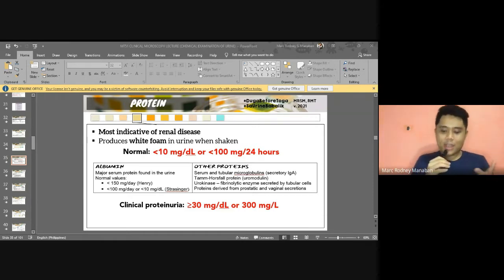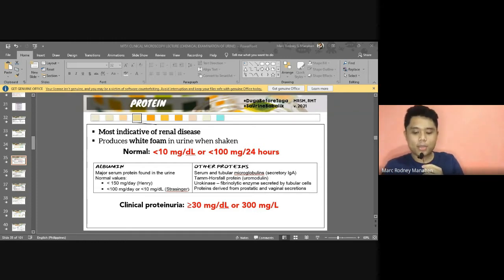All right. So again, we have already started, as I mentioned, with the first two parameters, specific gravity and pH. And we have discussed thoroughly, hopefully, the different methods, principles, and clinical significances of these two parameters. So I hope it is clear. For this lecture, we're going to continue, and for this part, we're going to start with protein.